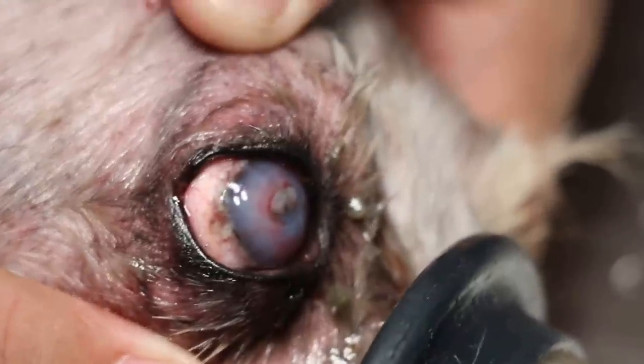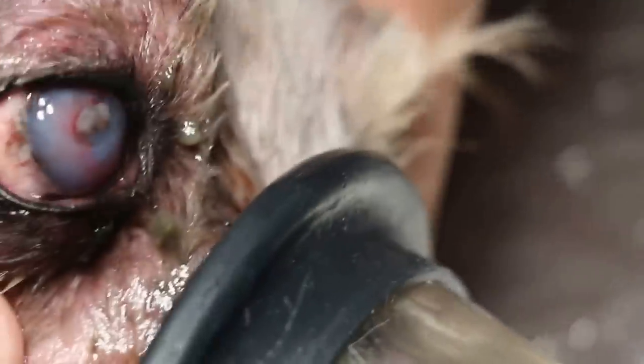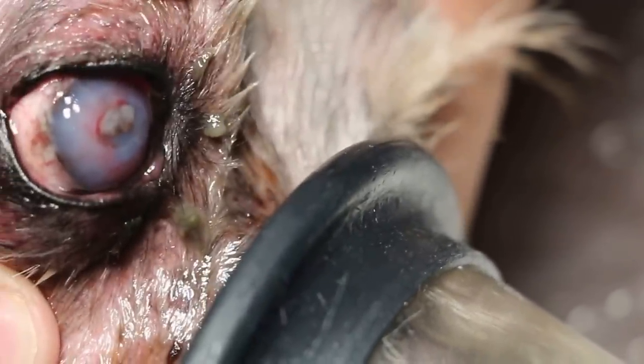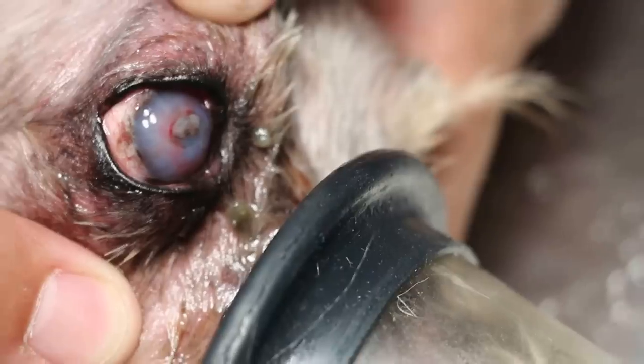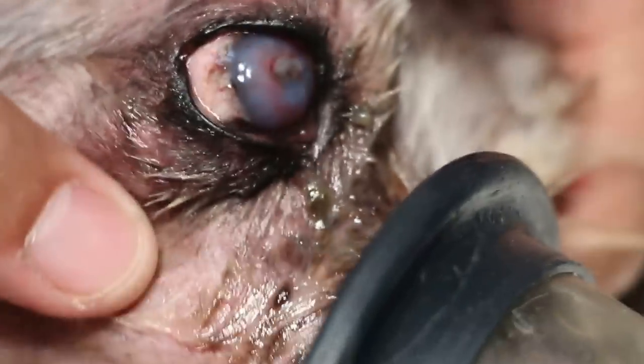When you see the original image, you see the hole there, but not the scar tissue, the white tissue. So put the eye ointment. Clean up the eyes. Clean already. Clean up now. Especially anything inside, all the dirt, everything.